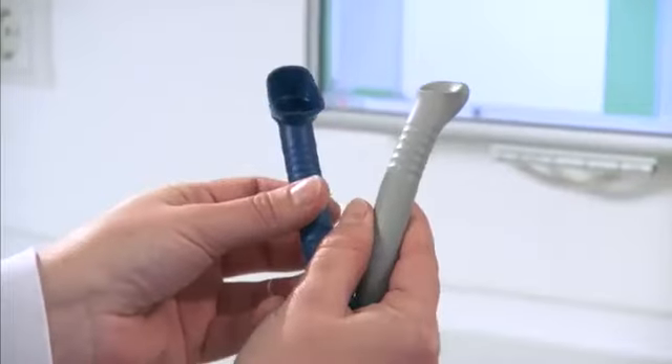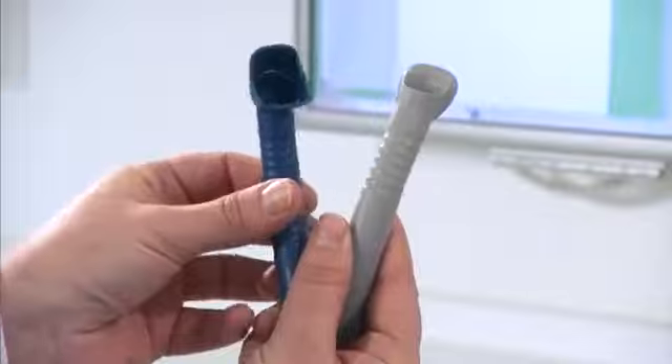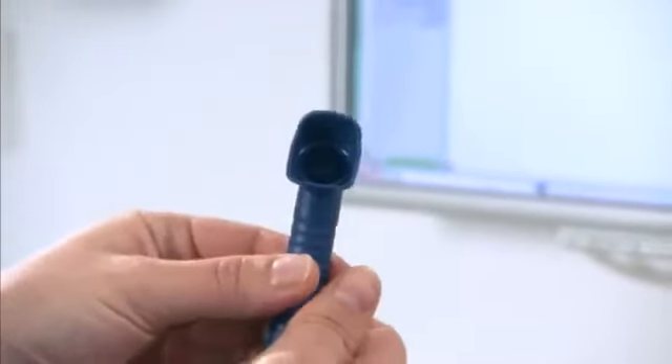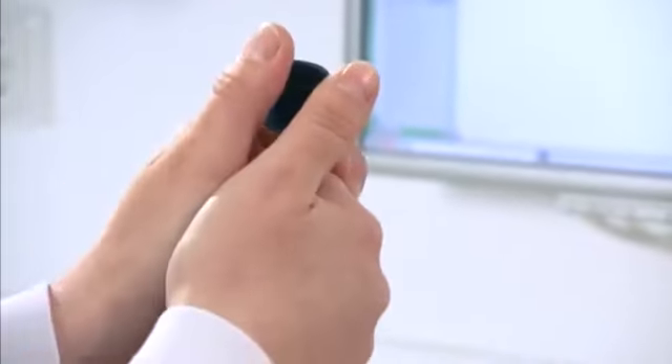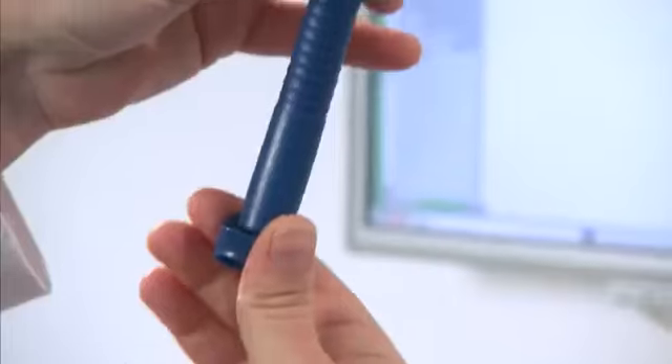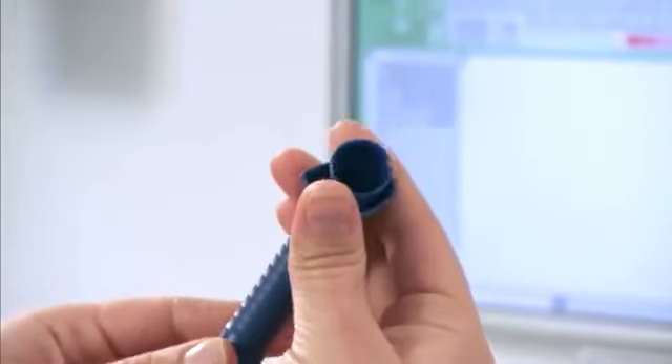A direct visual comparison of prophylaxis cannula and universal cannula clearly shows the difference in shape. The protective shield for the cannula is easily removed for cleaning, disinfection and sterilization. The shield is effortlessly clicked on for treatment.